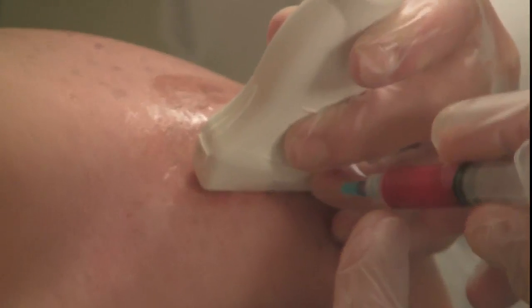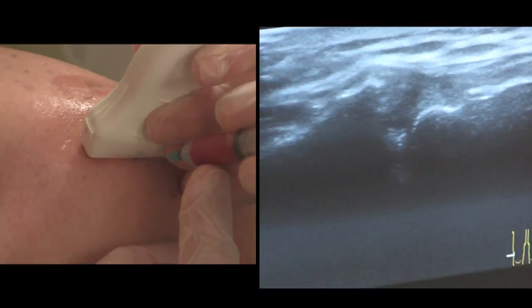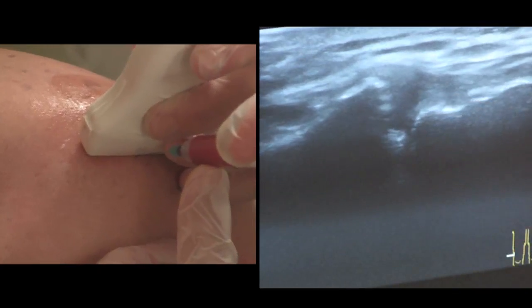And again, under ultrasound guidance, we can see the needle being introduced into the acromioclavicular joint and the solution being deposited.